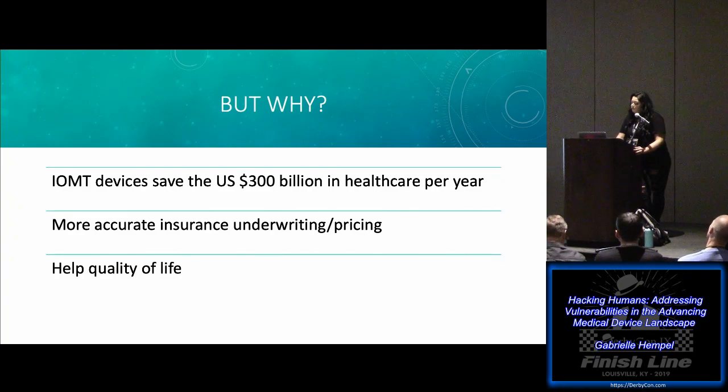The devices will also help improve the quality of life for many of the patients that use them. Remote monitoring is made possible by connected medical devices and allows healthcare providers to capture patient data instantaneously, as well as allow the patient to live their life more normally than they previously may have been able to.